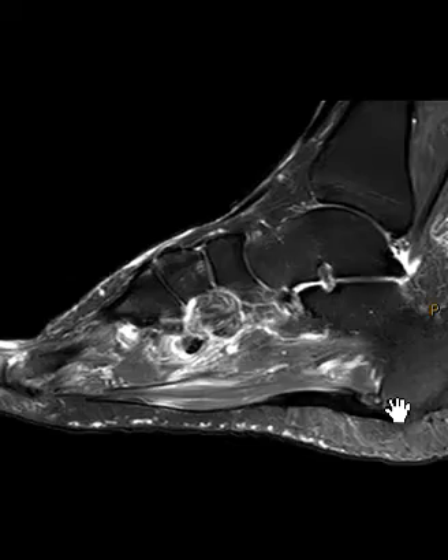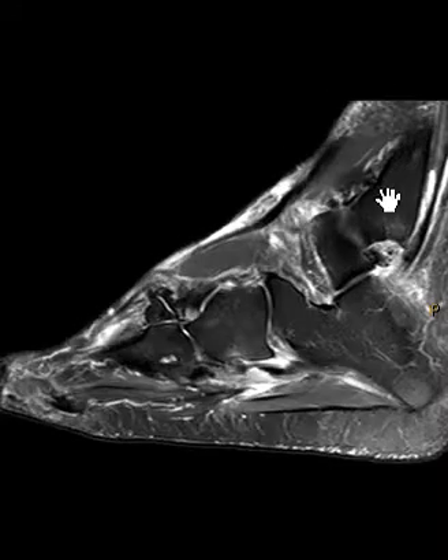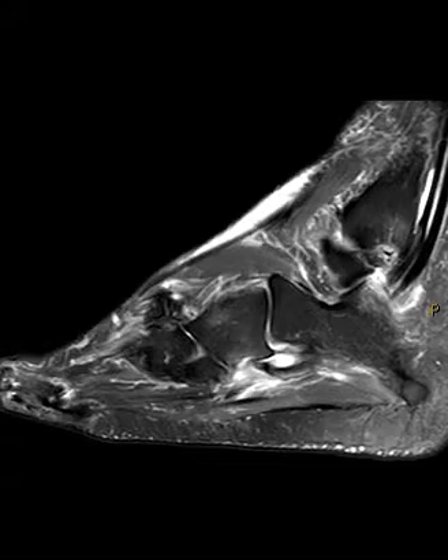Now we're going to go off to the lateral side where we see this little bone, the fibula. Behind the fibula we're going to see two things: the peroneus brevis up front and the peroneus longus in back. The peroneus brevis has fluid around it — this white stuff is fluid — so there's fluid about the tendon sheath. This is tenosynovitis, or if there's an injury it can be related to that, but this is abnormal. Both of the tendons are intact, but again that fluid is abnormal.